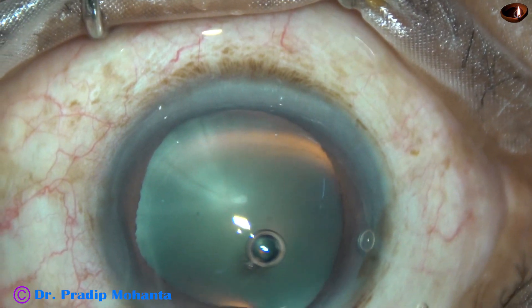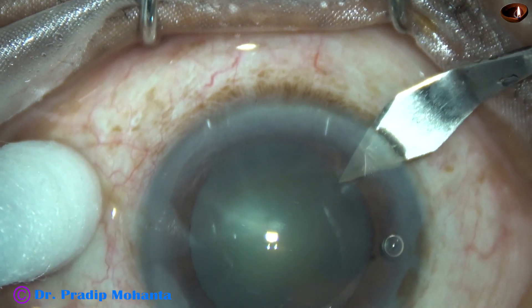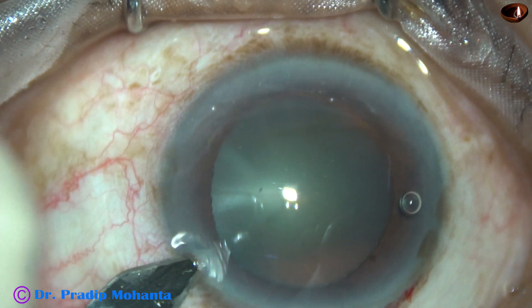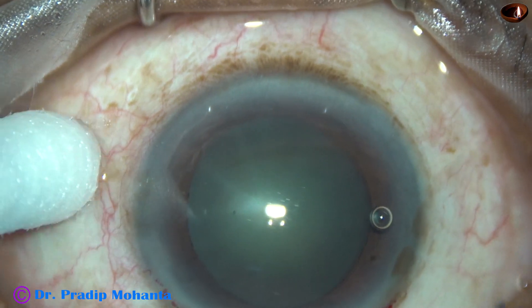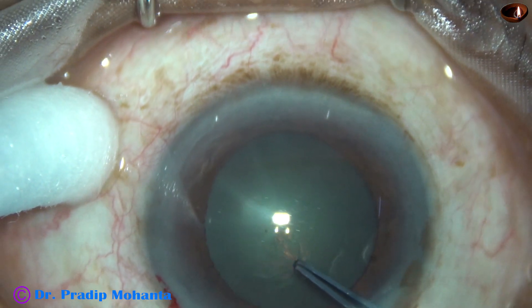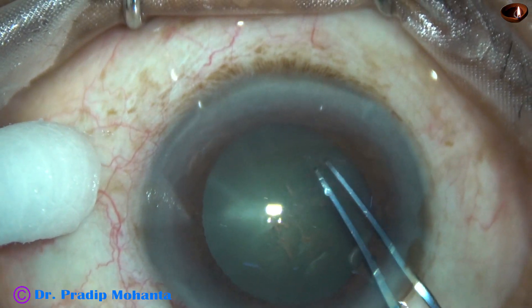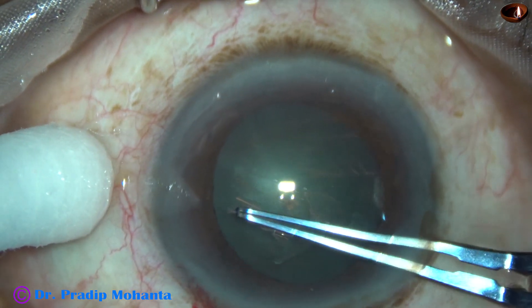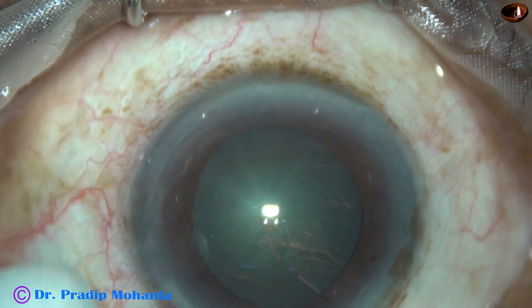In this case, by this time, the incision has been made, the anterior chamber has been filled up with visco, and two side ports are made on either side of the main wound. I haven't stained the anterior capsule with trypan blue dye, and the red glow is not good. But still, I can see quite well and can do the rhexis nicely. It doesn't matter much whether you have red glow or not — you can do very good surgery without red glow.